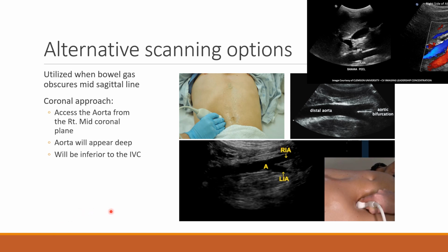So as I mentioned, you're going to want to measure that aorta in proximal, mid, and distal and assess, making sure that it's 2 or at least under 3 centimeters. If you see it enlarged all the way down, that would be considered more of an ectatic aorta, whereas if you see a focal enlargement, that would be then your aneurysms.